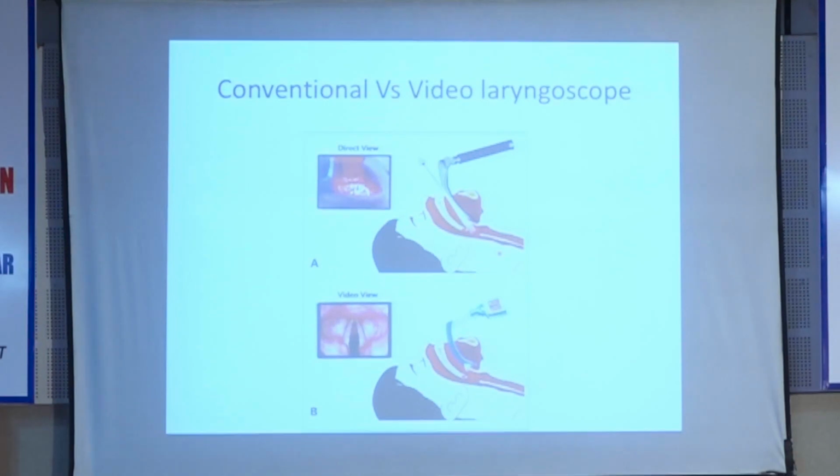But still, even if video laryngoscopes are available, people are not using them because there is some kind of inertia to use them. But let me tell you, you must practice video laryngoscopy in normal patients. Today, we are going to give you a lot of practice with video laryngoscopes. Why? Because video laryngoscopes change our vision.